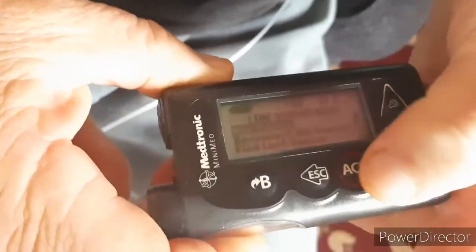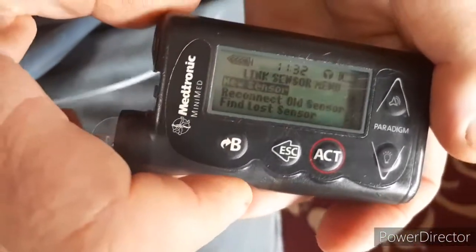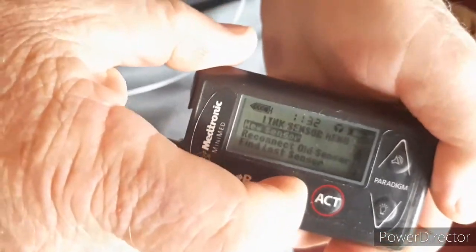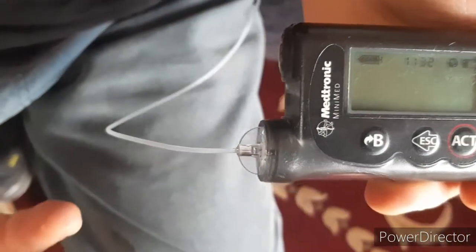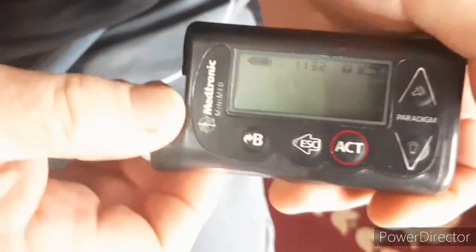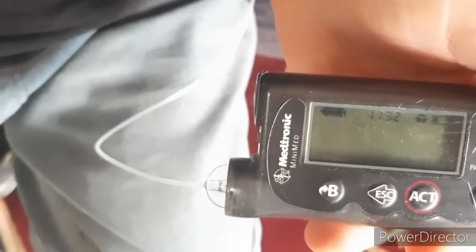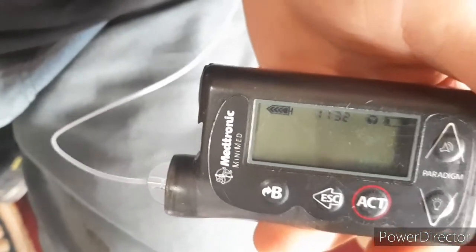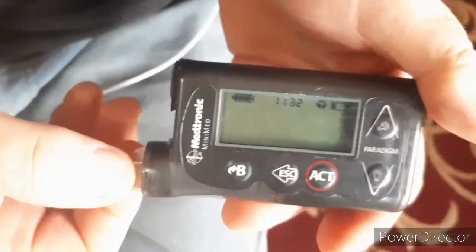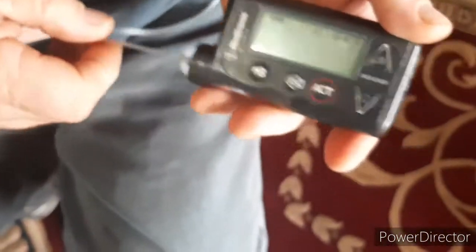The pump will tell you it needs two and a half hours, after which you'll have to do a blood glucose reading. Escape back to an empty screen. Your sensor is now logged in and will become fully active after you complete that first blood glucose test.